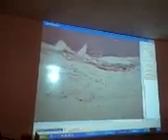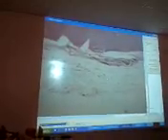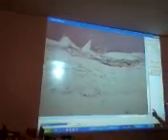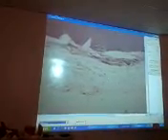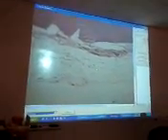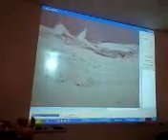Whereas the other places we were looking at, that outer rim is a very thin, just layer of parietal peritoneum. Here it's actually adventitia, which is a pretty thick connective tissue, much more dense and fibrous structure. So the large intestine is mostly retroperitoneal, so it's behind the peritoneal space. So this is not going to be serosa. It's going to be adventitia, which is a lot more dense and tough. That's why you're seeing this very wide edge, where you saw in the previous ones, you just saw a very thin rim. So that's what's going to be looking different for you. So don't mistake this for some kind of muscle or something.